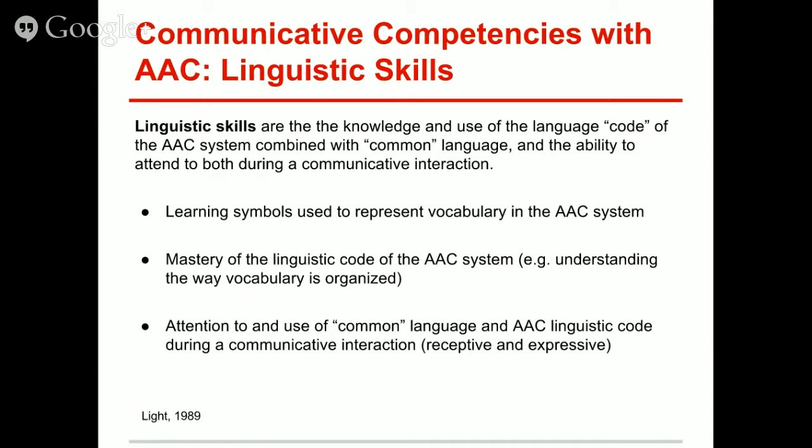For example, during a cooking task, the AAC user needs to direct the next step in the recipe, which is sprinkle with croutons. Using core vocabulary, she uses her AAC device to speak, "put it on top."